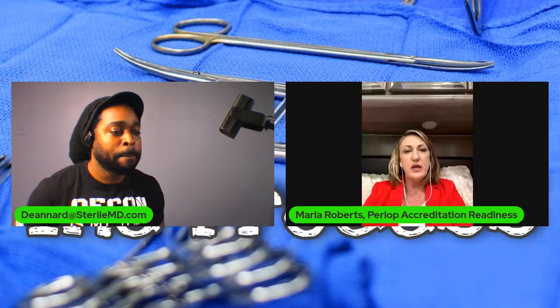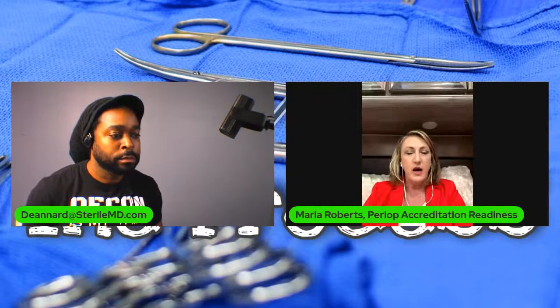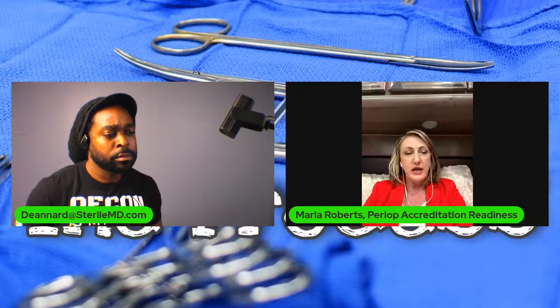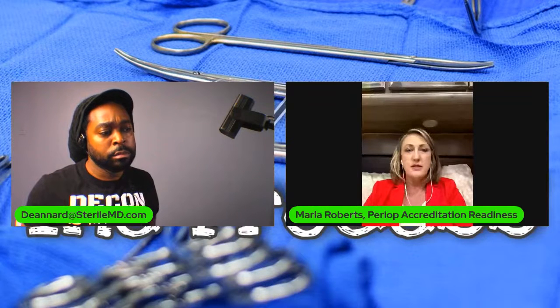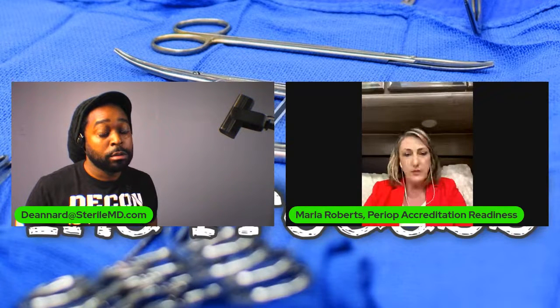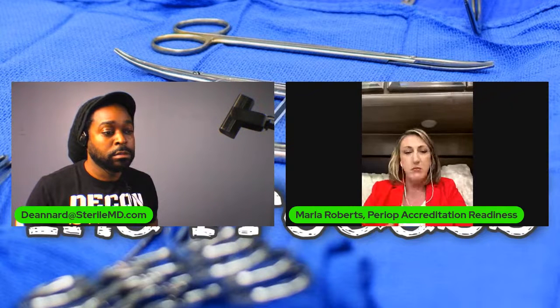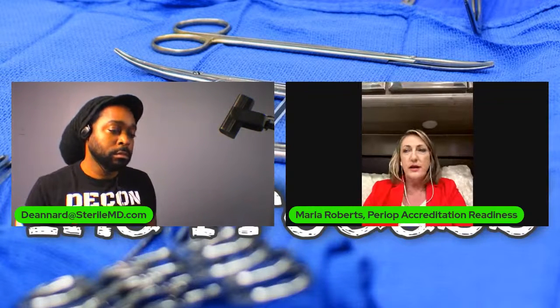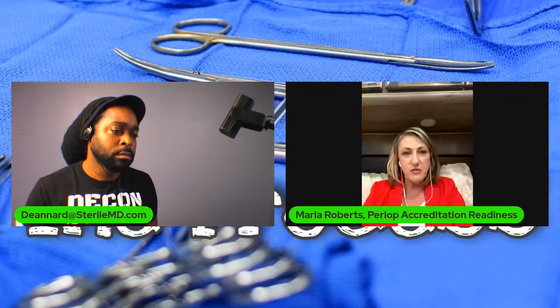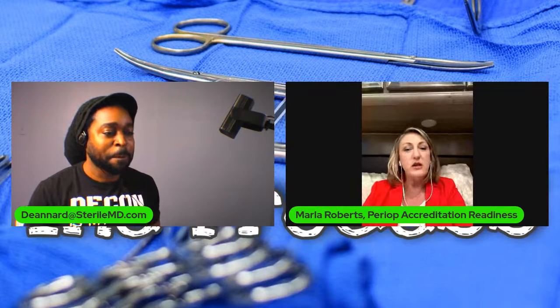It's frustrating for me because I see a lot of hospitals that are not doing the right thing, but I hear from them, well, Joint Commission's never cited us for this. And one hospital that I was at this past year, it was absolutely horrible. We're talking roaches. We're talking through the washer. They were putting things in their cart washer. They were putting rugs from housekeeping through there. They were putting carts from the cafeteria through there to clean. There was dirt, mud, debris in the bottom of the washer. And there are water bugs and roaches. And we're seeing, how did you just have Joint Commission? How did they pass you? Who are you using for your consulting firm? That's one of the questions.